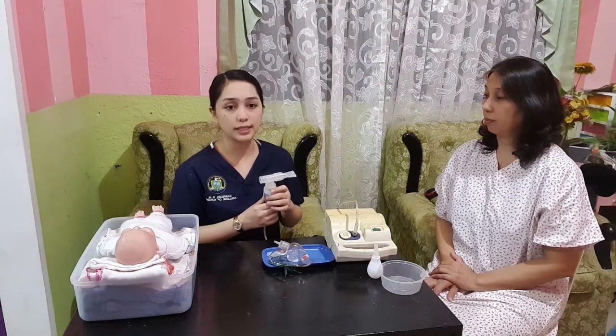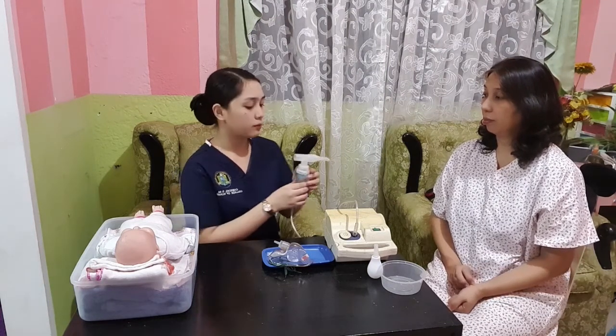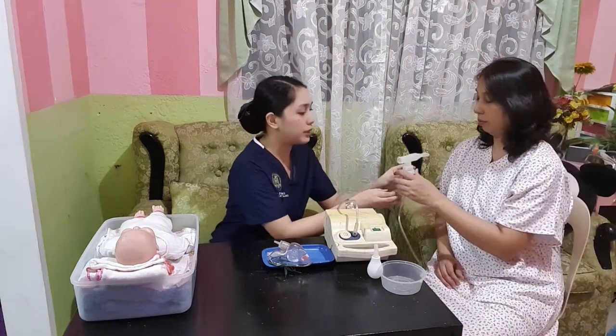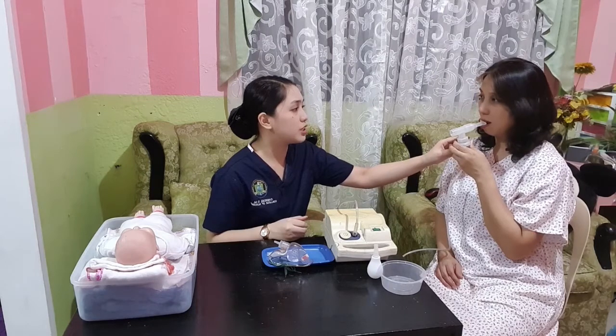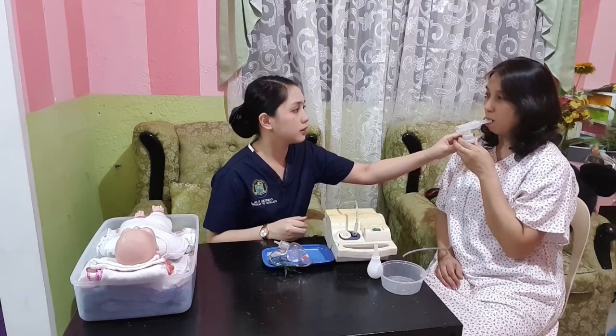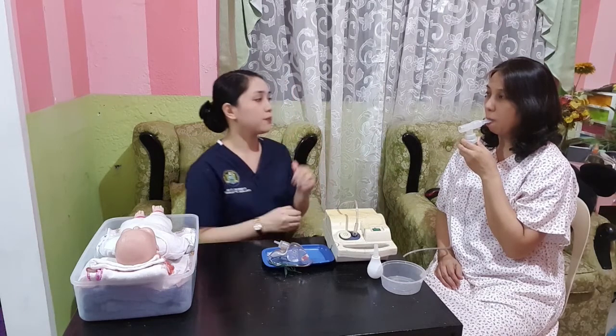Then I will have the patient hold the mouthpiece between lips with gentle pressure and offer assistance until he or she can perform inhalation. So ma'am, can you hold this and put it to your mouth between your lips with a gentle pressure. Insert it between your lips, okay?